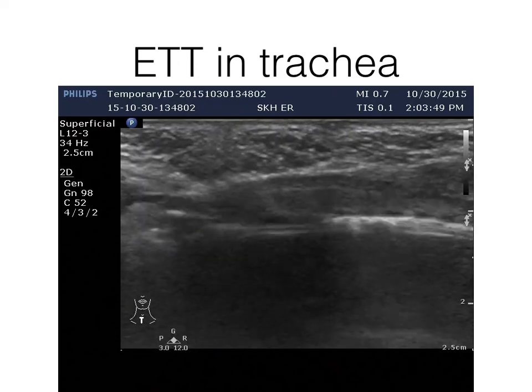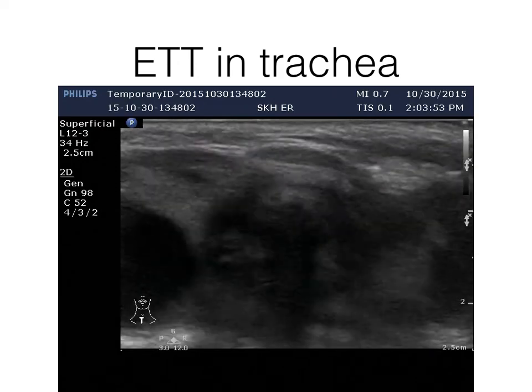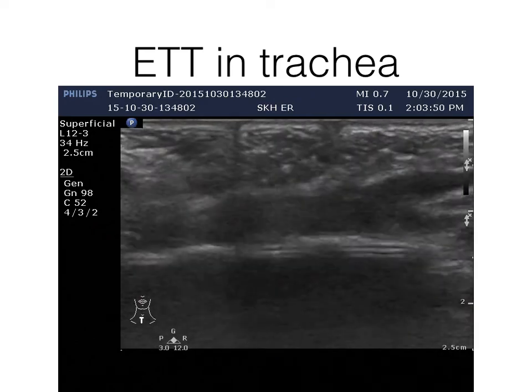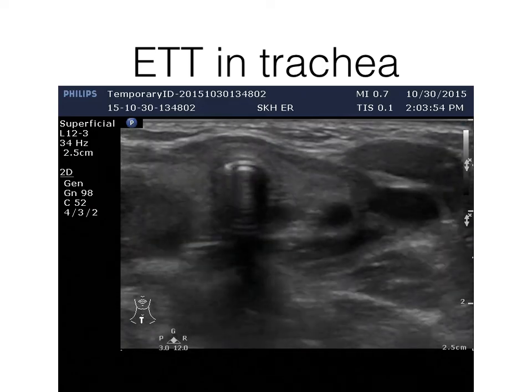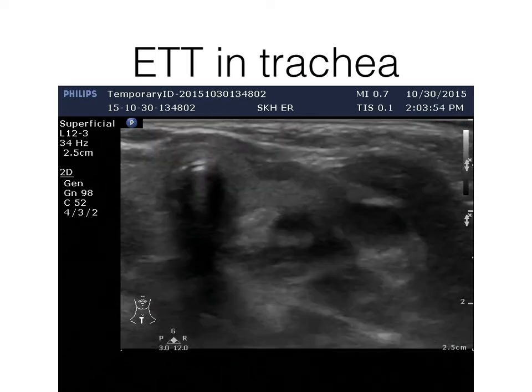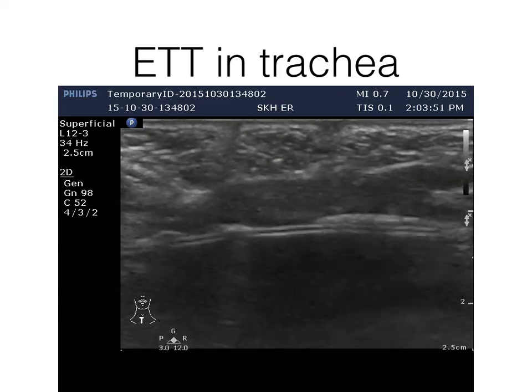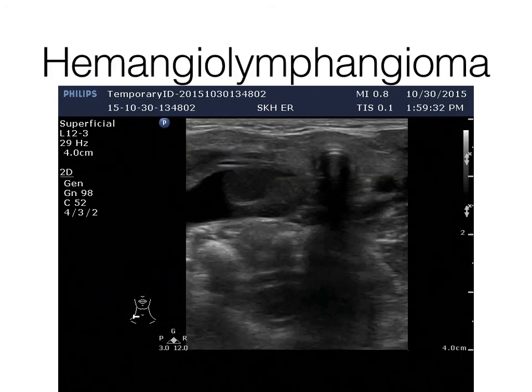So see, the esophagus is collapsed without double track. So we can manage the airway immediately and not confirm later on by bagging and confirming by the end-tidal CO2. Because it depends on the capnography, it needs you to bag for maybe 6 ventilations to get a good reading to confirm that.